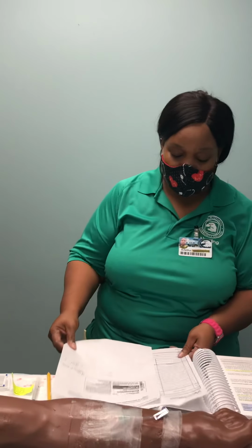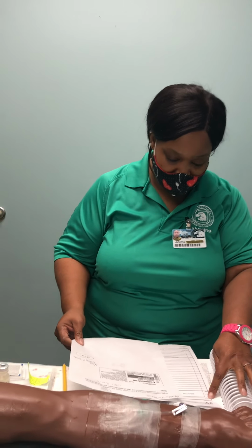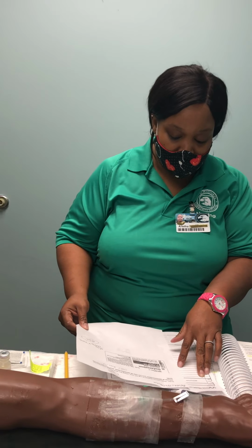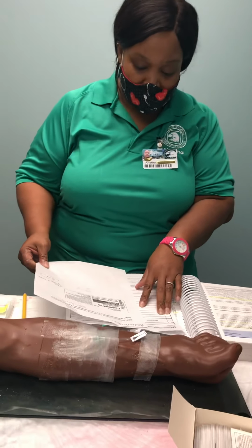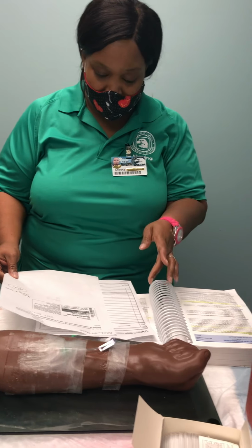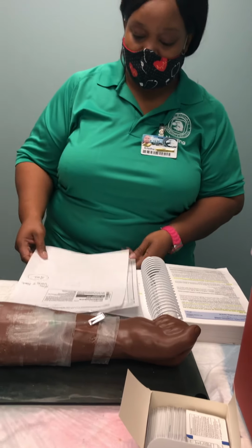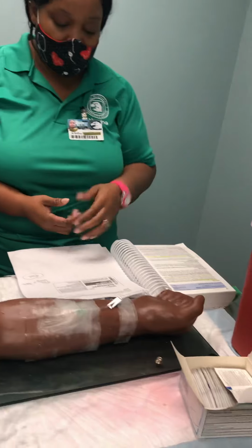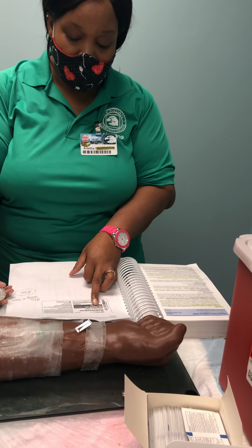Okay, I will check with my MAR, and I'm checking for allergies. I'm checking for the patient name. I'm checking for the medication, which is Zofran 4 milligrams IV push now. The route is IV push. Time is now. I checked for allergies already, and I checked for the patient name, and the patient doesn't have any allergies.